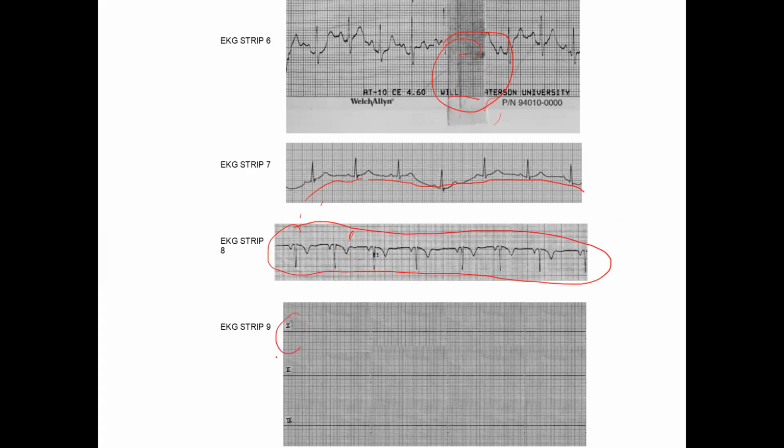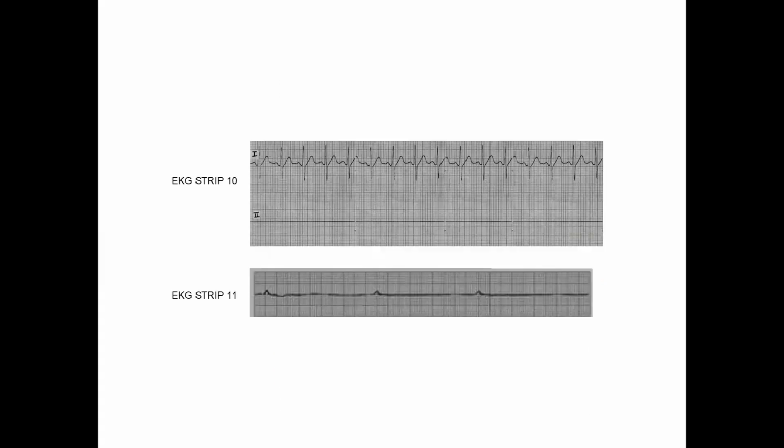This one, obviously, all the leads fell off, all the electrodes fell off. So these are limb leads 1, 2, and 3. You can't get any readout, so you have to redo it, that's all. Believe it or not, usually the first time the students do it, it works out great. So lead 2 is not showing anything because the lead fell off, probably off the left leg. So one of the leads fell off is the thing.